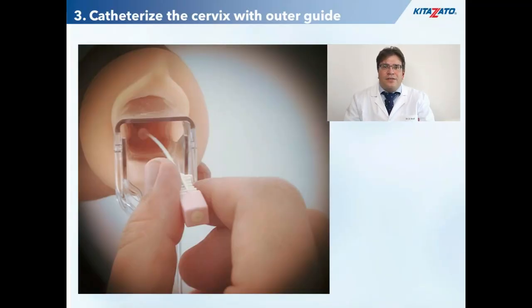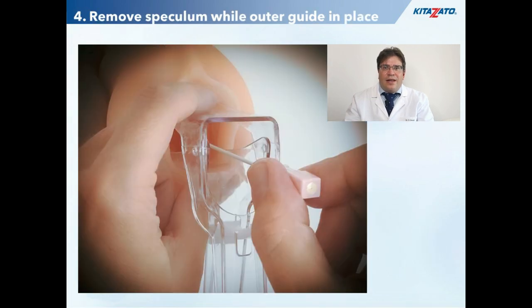The next step is to canalize the cervix with the outer guide. Often you have to do a rotating movement — in case of an anteverted uterus from lateral to anterior position, and in case of a retroverted one from lateral to posterior position. Next, the speculum has to be removed while keeping the inserted outer guide in place. With a Cusco speculum which is not open on the side, you have to remove the speculum in a slightly opened position while gently pushing the proximal tip of the inserted outer guide through the opening.